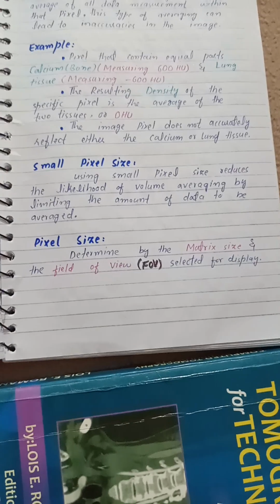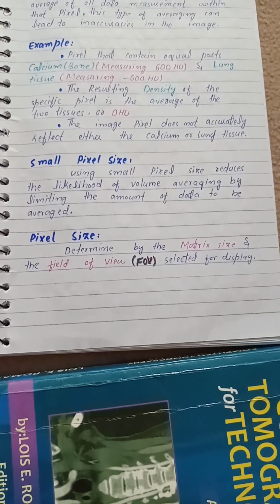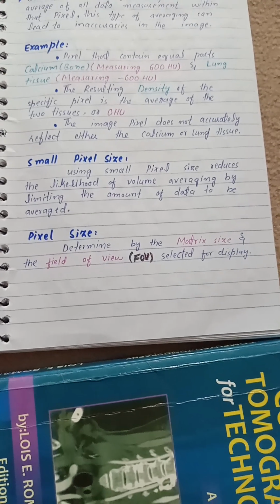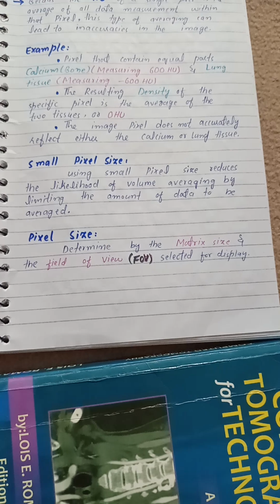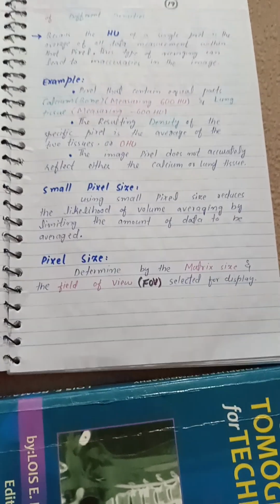Small pixel size. Using small pixel size reduces the likelihood of volume averaging by limiting the amount of data to be averaged. Pixel size is determined by the matrix size and the field of view selected for display.